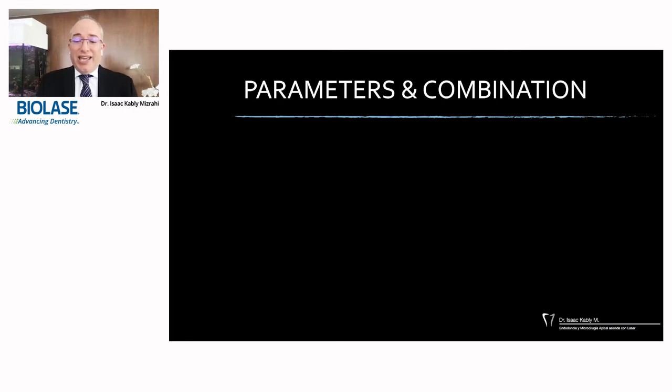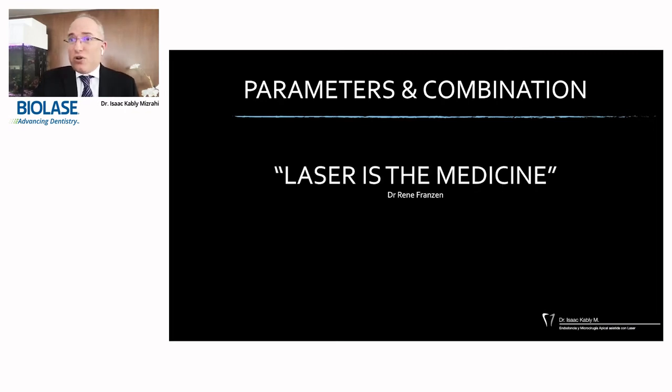If this is not permitted in your country, then at least use the diode laser for photobiomodulation. A question might arise on why we don't always use it for disinfection this way, outside of the mouth and in contact. And the answer is simple. The energy density we use inside the root canal is very different.